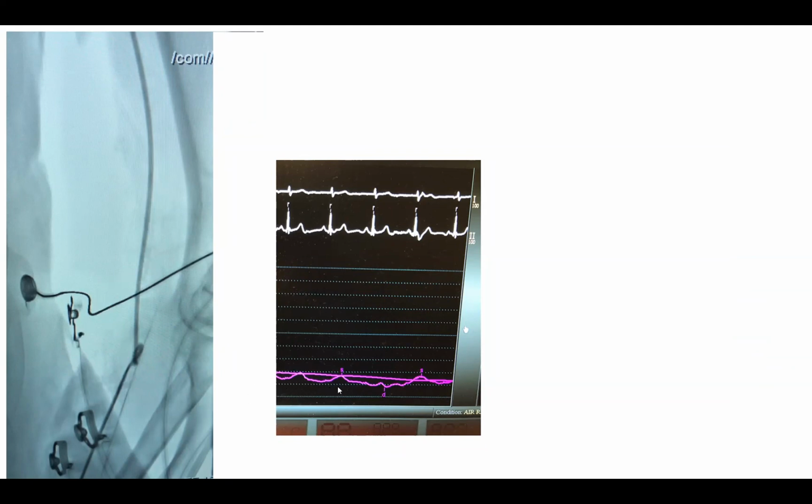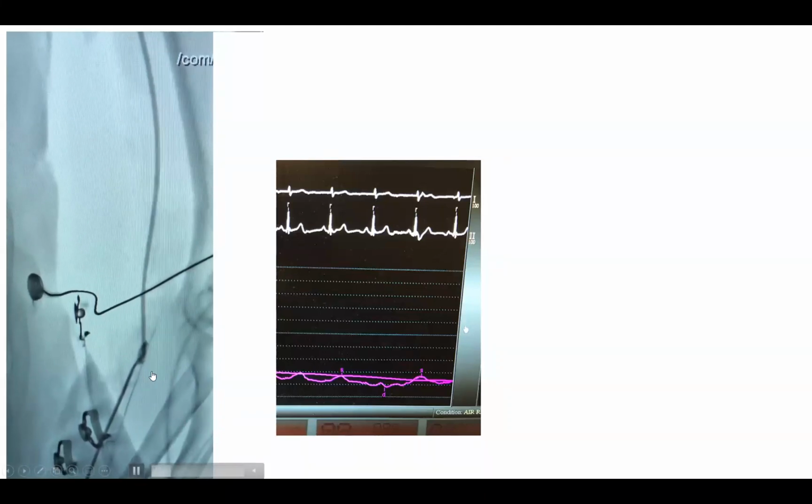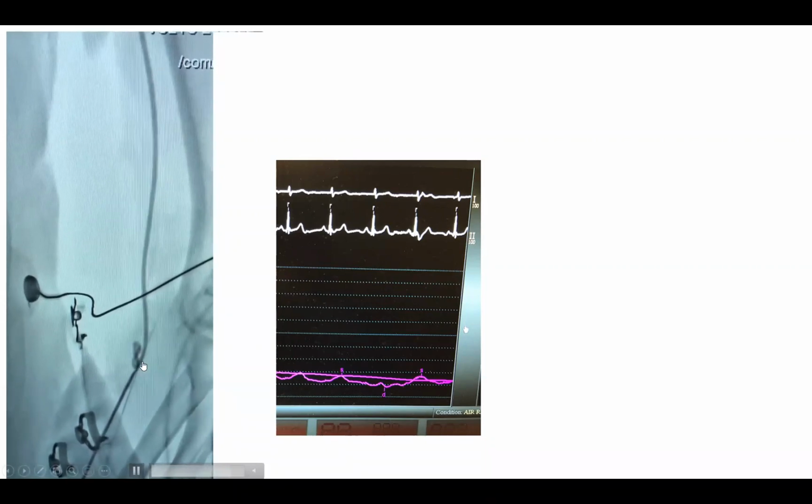It may dampen or become very funny, but honestly, in my experience, when the catheter kinks, you just lose the pressure. Your screen becomes empty. You don't have any pressure tracing anymore. It's totally lost. So that's your early hint. And please don't keep torquing when this happens, because this is what happened. You eventually get not just a kink, you get a knot. Look at this. You see, this is a knot here. And that becomes very hard to take out.